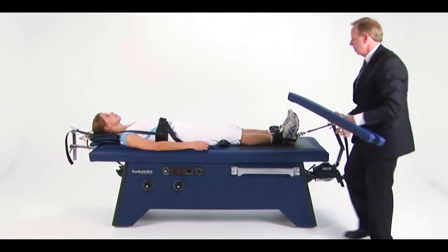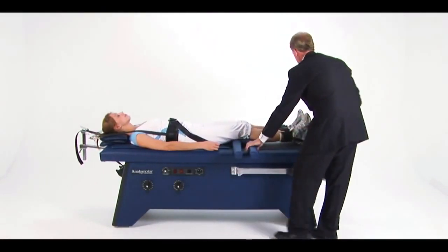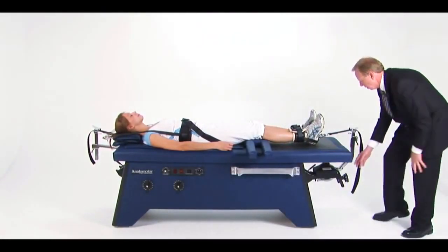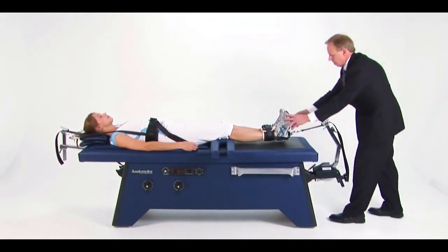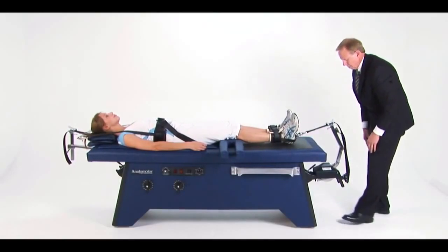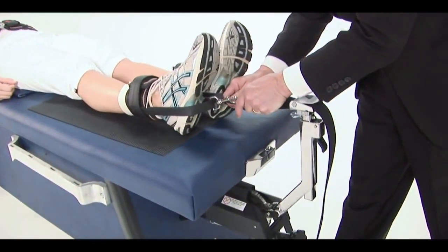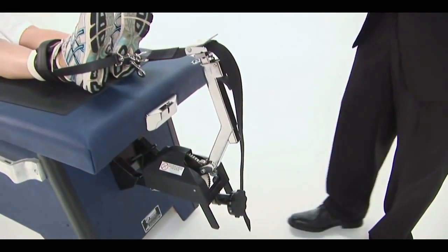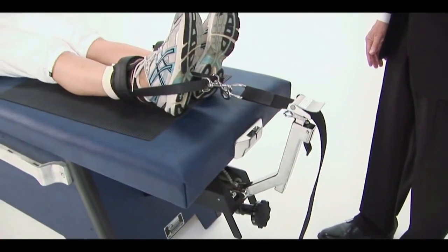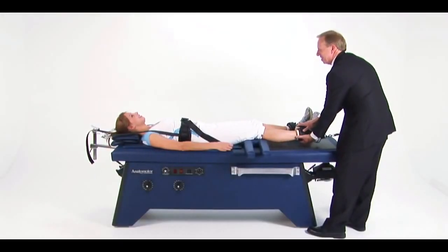With the tabletop in motion, slowly increase the poundage over 2 or 3 cycles. The most frequently used poundage is between 1/4 and 1/3 the patient's body weight. Single leg traction, usually to the short painful leg, has often proved effective in treating sciatica. After administering traction to both legs for 2 or 3 minutes, grasp the web strap and unclip the unaffected leg. Then, reduce the poundage to half the previous setting.